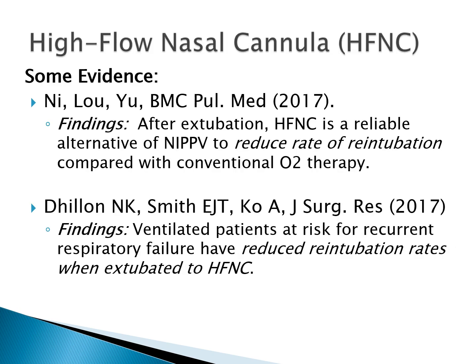So, drilling down a little more deeply on some of the choices we have to extubate patients who may need some adjunctive help to bridge them from mechanical ventilation to total spontaneous breathing. So, high flow nasal cannula.